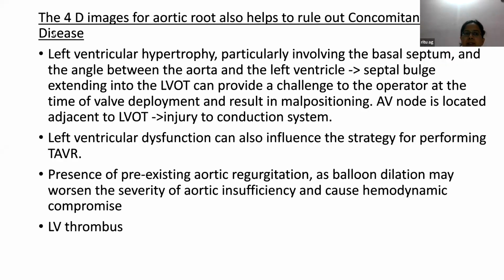Now, sometimes these 4D images, besides all the information, the 6 points that I mentioned in the previous slide, we also get other useful information. For example, we see the LV hypertrophy.